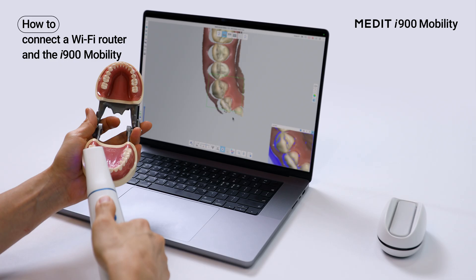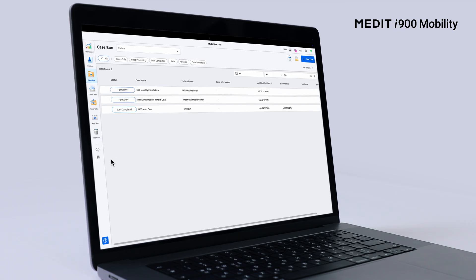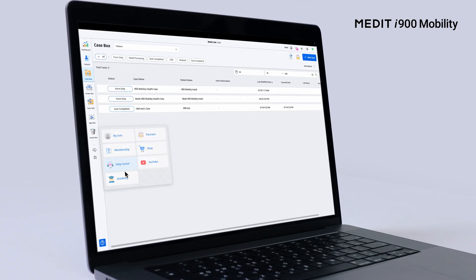This completes the installation of the Medit i900 Mobility. For more information, please visit our Help Center.